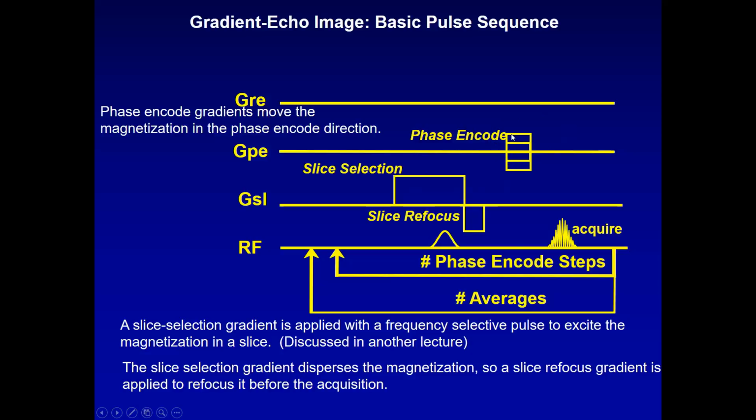And that gives us, in the previous example, each row location for the K-space Y dimension. I've only drawn 1, 2, 3, 4, 5 levels here, but typically you would have 64 or 128 or 256. By the way, the fast Fourier transform needs powers of 2, so we often choose that number of dimensions in our phase encode direction. And the other sampling direction I'll tell you in a moment.